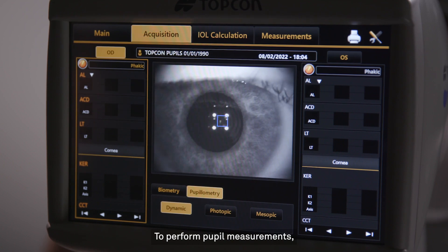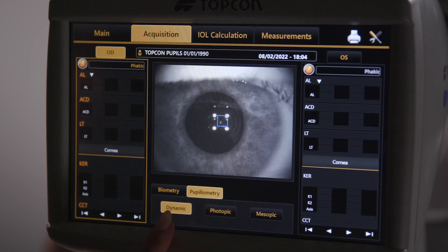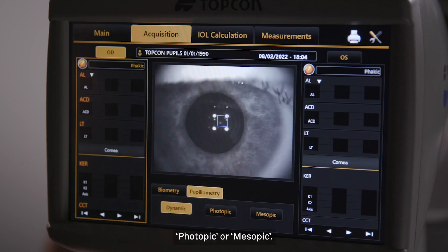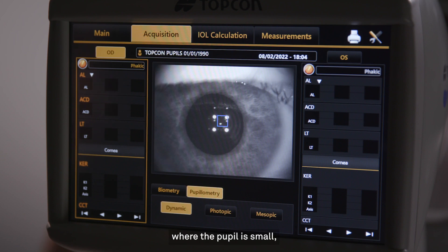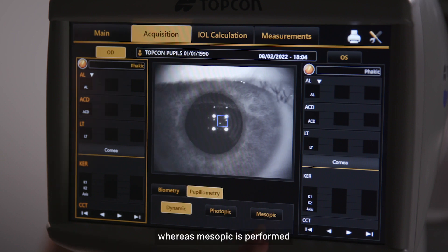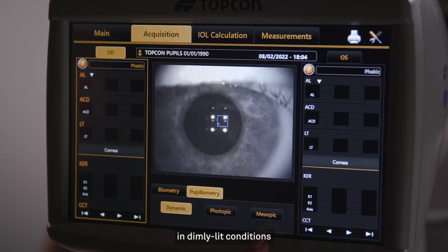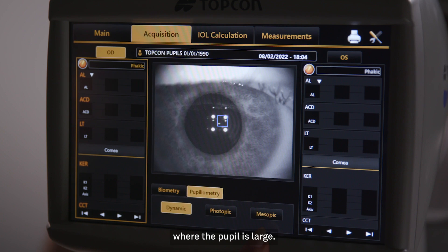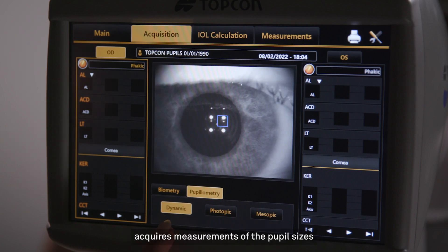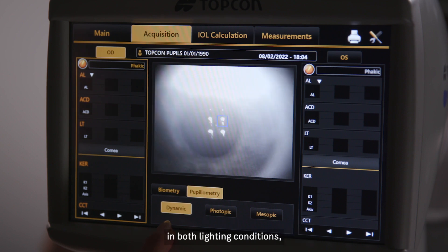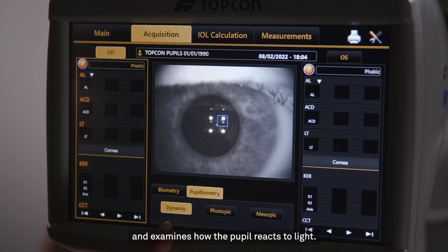To perform pupil measurements, select the Pupillometry option, then select Dynamic, Photopic, or Mesopic. Photopic testing is performed in well-lit conditions where the pupil is small, whereas Mesopic is performed in dimly lit conditions where the pupil is large. Dynamic testing, which is the default choice, acquires measurements of the pupil sizes in both lighting conditions and examines how the pupil reacts to light.